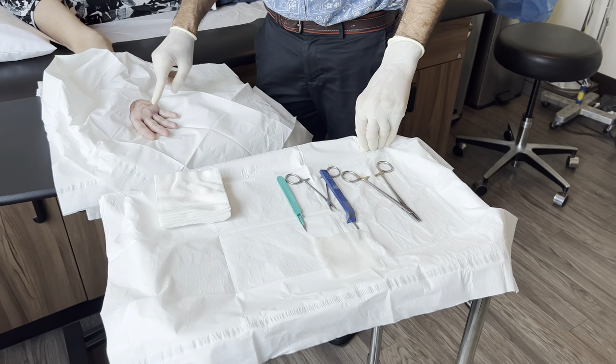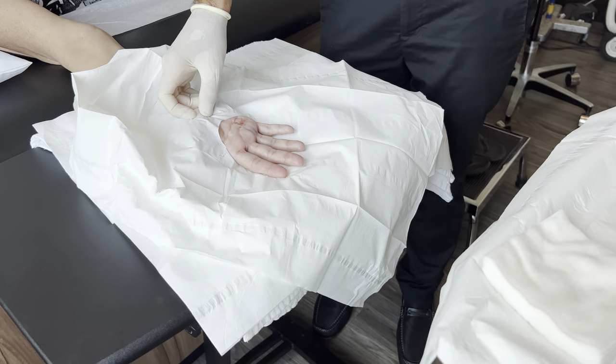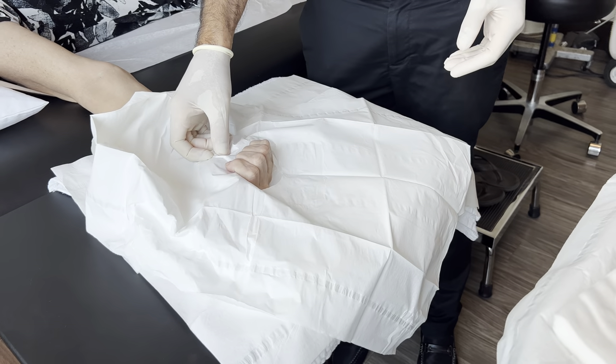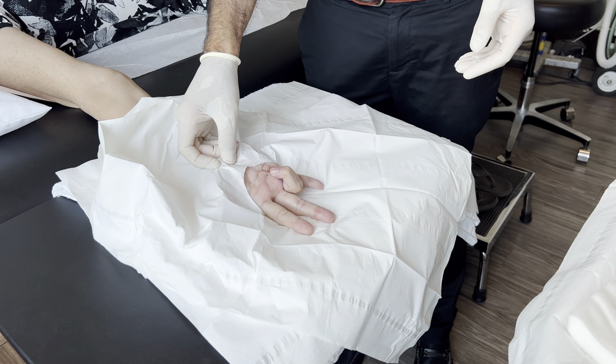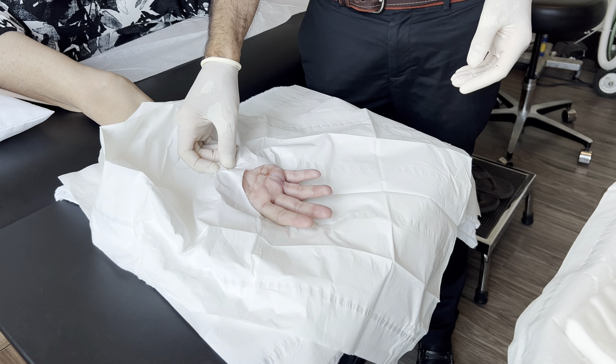We're going to be doing a ring finger trigger finger. She's already been numbed up. Can you make a fist for me? Real hard. Squeeze really hard. Squeeze the ring finger and now straighten out. Try to straighten out really hard. Straighten out? Yep, and you can see the finger is triggering.